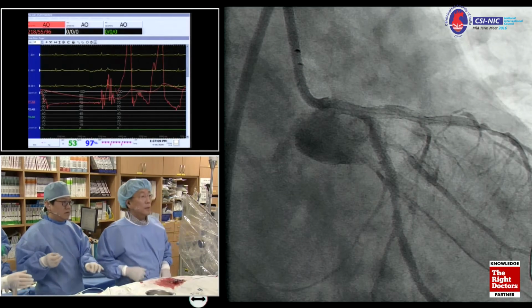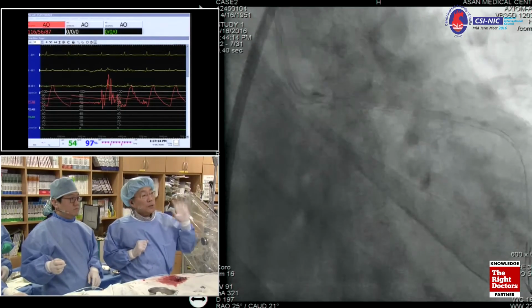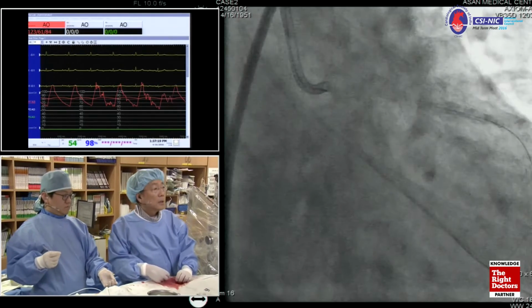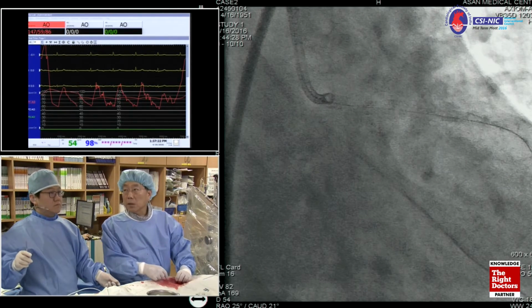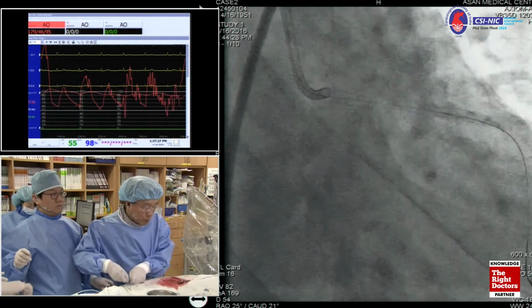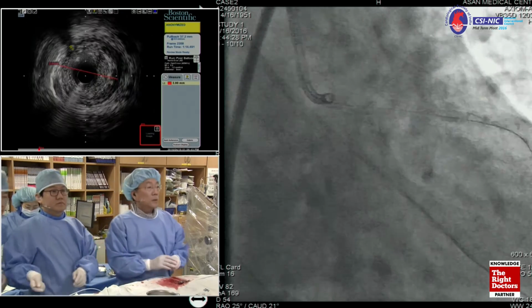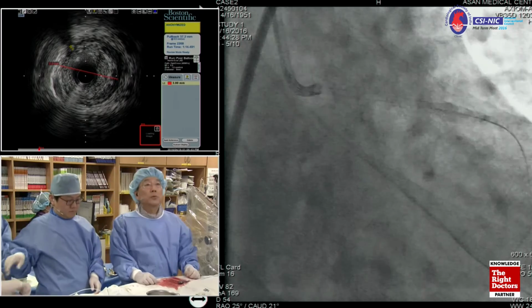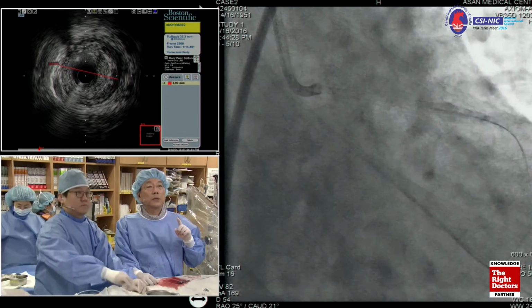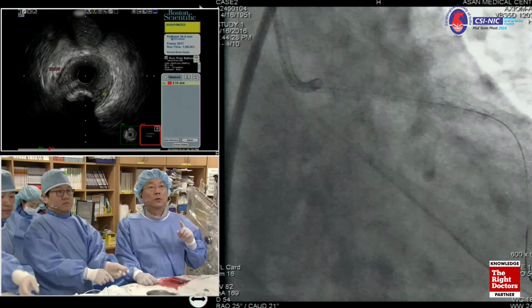Okay. Ooh, I like it. Angiographically, I think it's quite perfect, right? And so we're gonna see. Would you show us the distal main and proximal reference vessel diameters? So what size would it be? Distal main and proximal LAD, right? Would you show that, IVUS? So 3.9. What is that? Distal main? Yeah, distal main. Okay. What about the proximal LAD? That one. Almost 4.